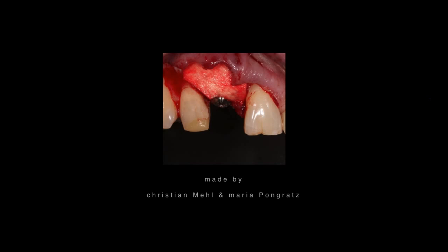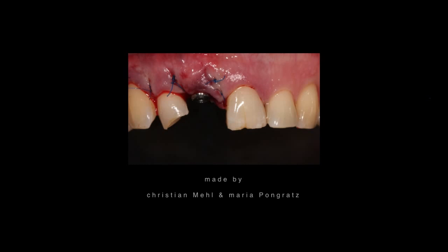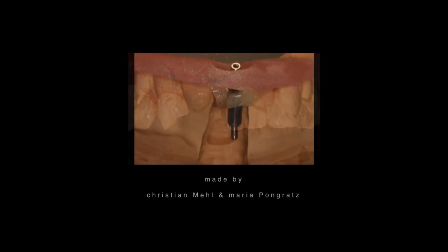We just filled the missing bone with bone of bovine origin, covered it with membrane, and are ready now to produce the temporary, which takes approximately 1 to 1.5 hours in the laboratory, and during this time the patient rests in our practice.